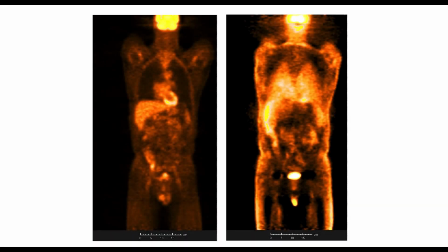And if you don't do attenuation correction, then you get the image on the right here. So you'll see here that there's lots of activity in the lung because it's not attenuation corrected. You'll see extra activity around the surface, around the skin. You'll also see some bright enhancing artifacts near the edge of some organs, like the liver here. It looks like there's a big enhancement on the lateral edge. So you need to do attenuation correction to not be fooled by those artifacts.